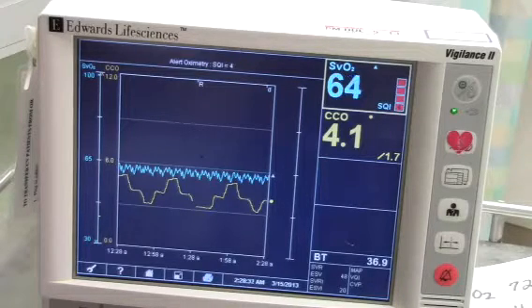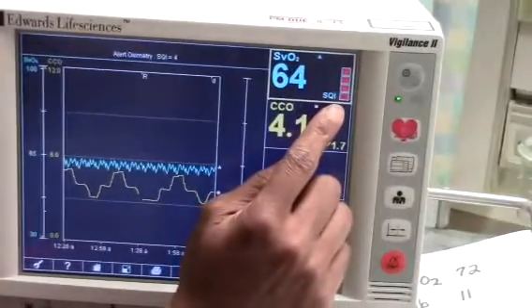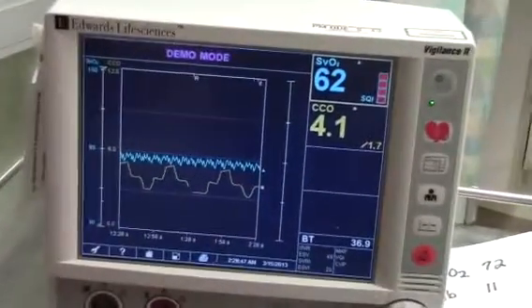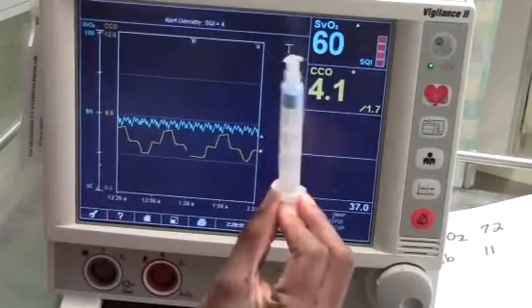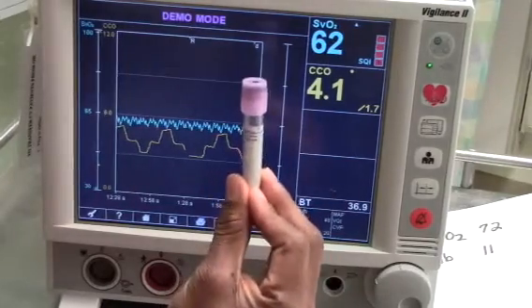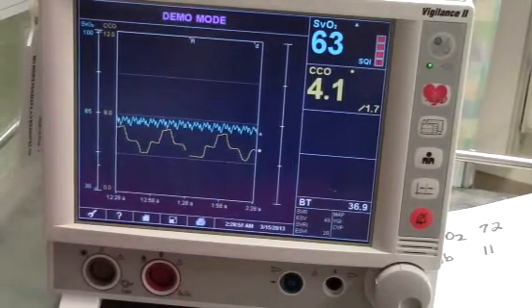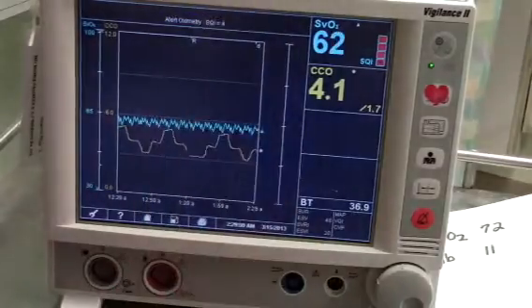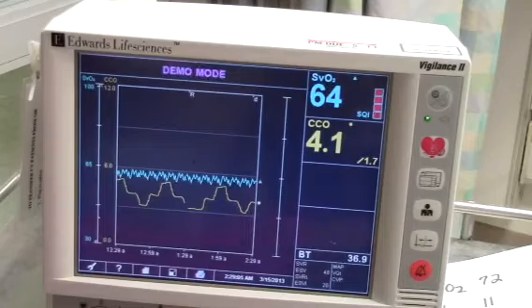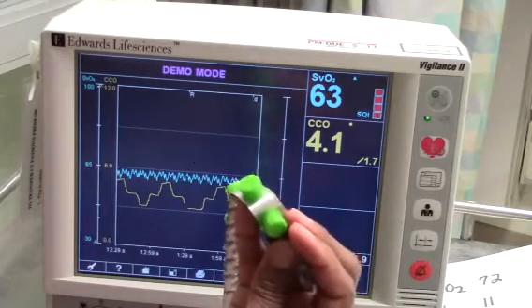Next, you will need a recent hemoglobin hematocrit result. Confirm the proper catheter position and a monitor showing the signal quality index, SQI, of 1 or 2. The equipment needed for in vivo calibration consists of a blood gas syringe, a purple top tube, a 10 mL syringe, an order for venous blood gas, and Curos caps to cover the port after obtaining specimens from the catheter.